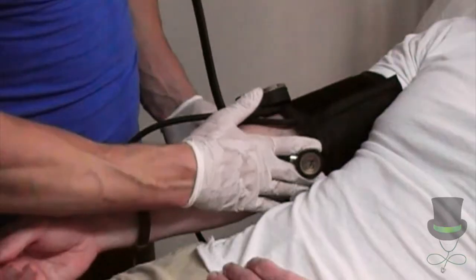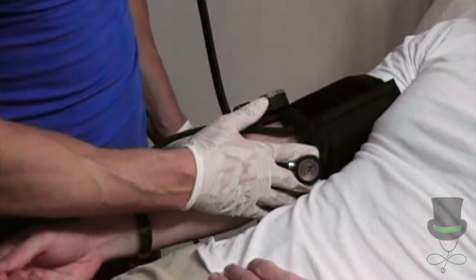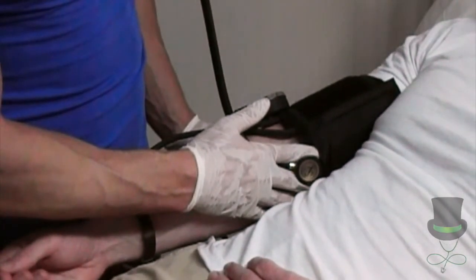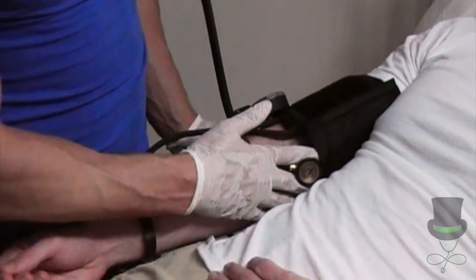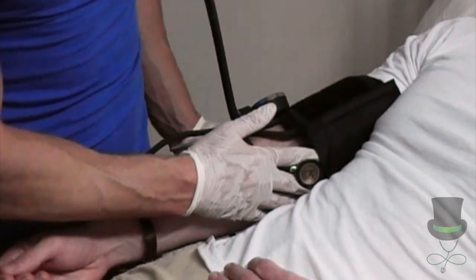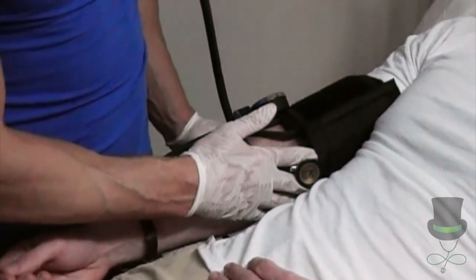Place your stethoscope over the patient's brachial artery and begin to inflate the blood pressure cuff. Once you can hear the pulse, keep inflating until you can no longer hear it. Once you hear the last bounding of the pulse, inflate approximately 20 to 30 millimeters of mercury past that point, and then slowly deflate the cuff.